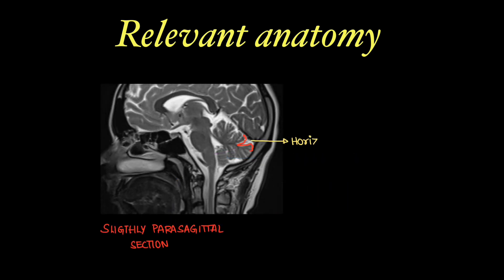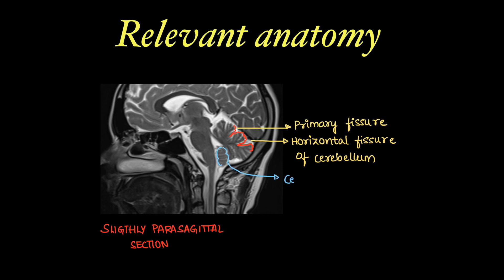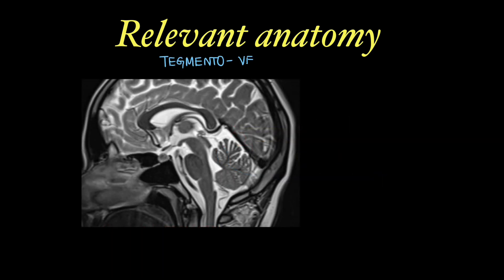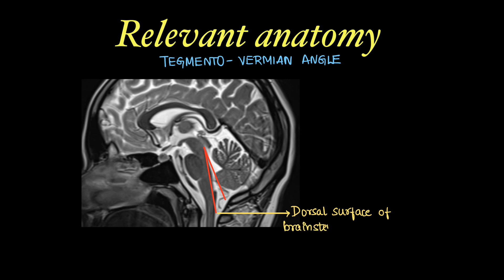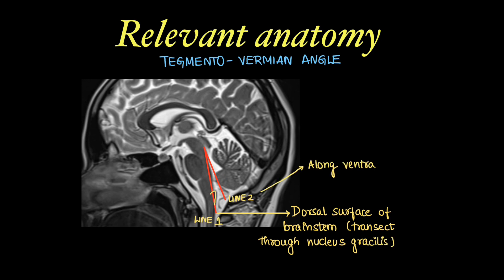Moving on to slightly parasagittal sections, this is the horizontal fissure of the cerebellum just beneath the primary fissure, and we can see the cerebellar tonsils. In suspected cases of posterior fossa anomalies, we calculate an angle called the tegmento-vermian angle. The angle is calculated between two lines: the first line is drawn along the dorsal surface of the brainstem transecting through the nucleus gracilis, and the second line is drawn along the ventral surface of the vermis.